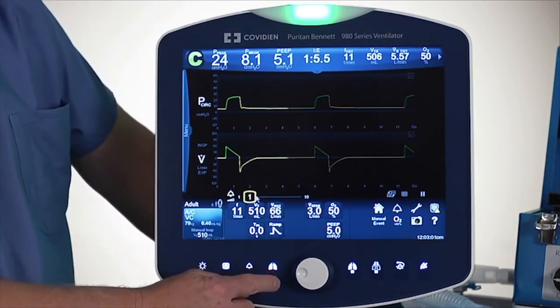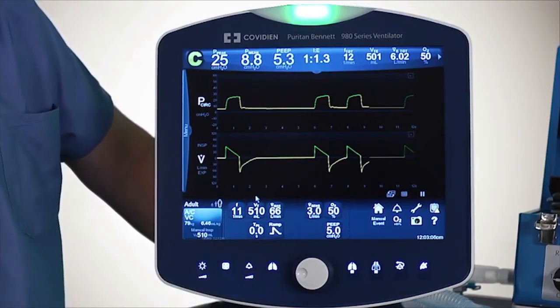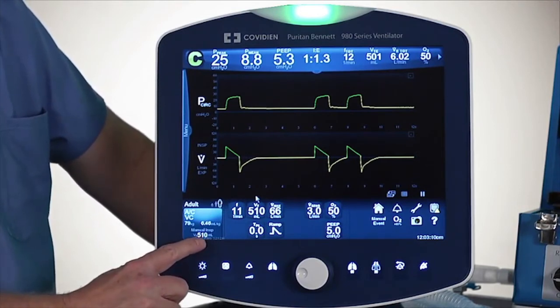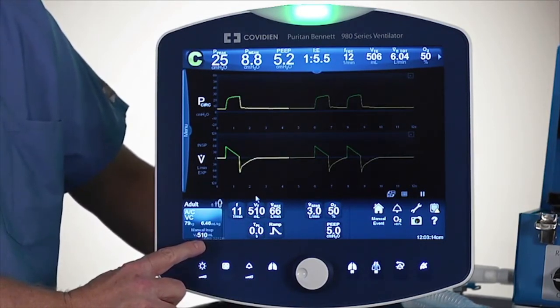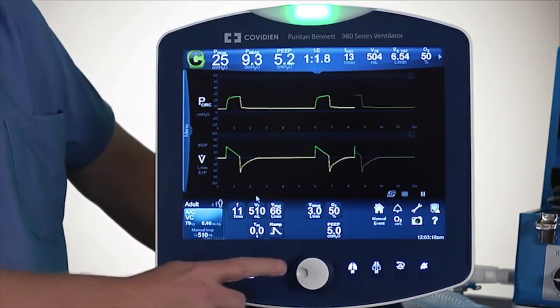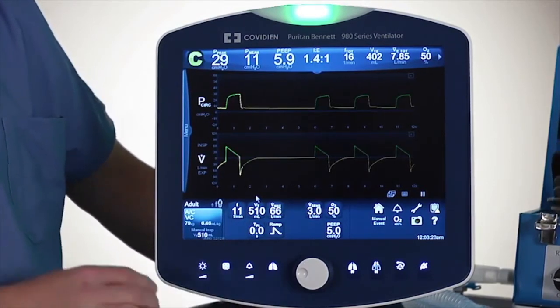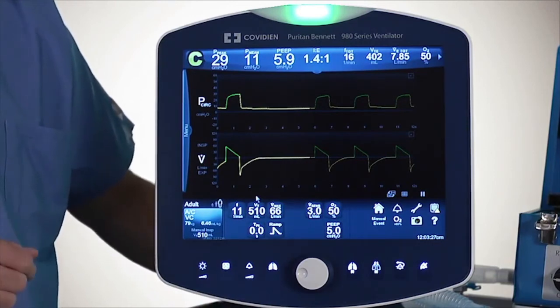Then you have manual inspiration. If I touch that, it gives a manual breath. To remind you, you're giving that volume based upon what was set earlier under the apnea settings — so I'm giving 510 milliliters every time I push the manual inspiration button. If I push it too fast, it won't deliver those breaths because it already knows it's in inspiration, so you get a little bit of a raspberry sound.